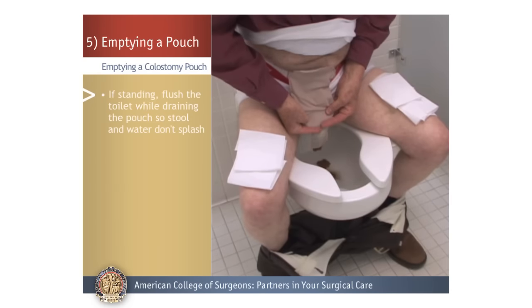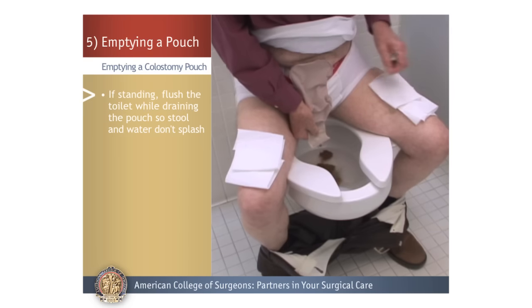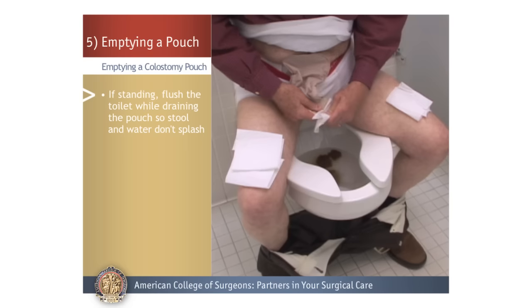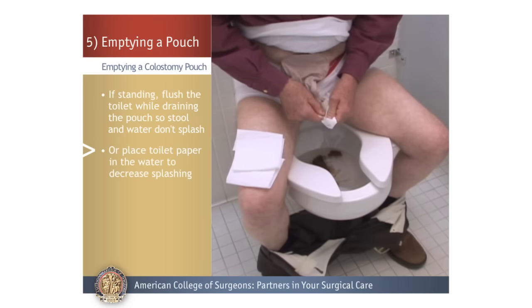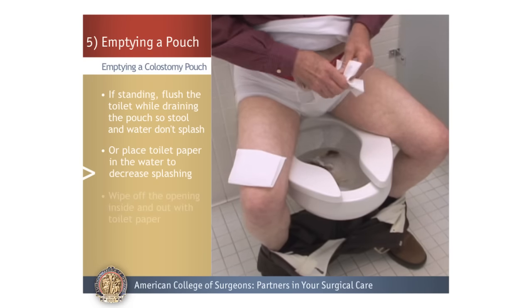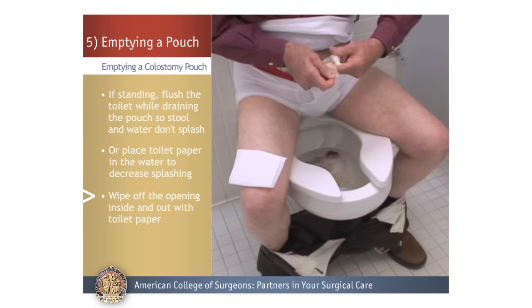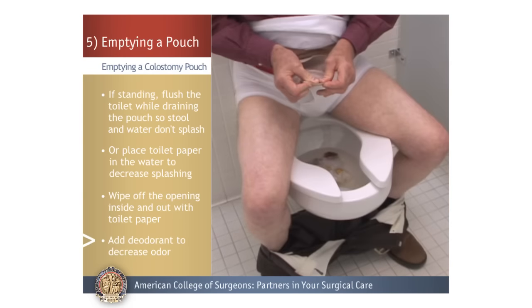If you're using a standing position, you will need to flush the toilet as you are draining the pouch so the stool and water do not splash up from draining at a high distance. You can also place a few pieces of toilet paper on the water to decrease the splashing effect. When the stool is emptied, wipe the opening off inside and out with toilet paper as shown. You can add pouch deodorant to decrease the odor before resealing the pouch.